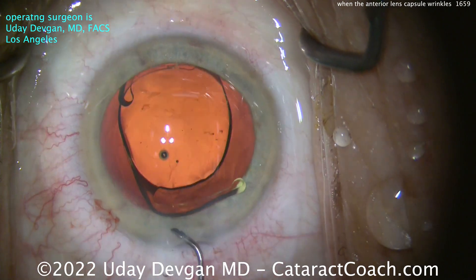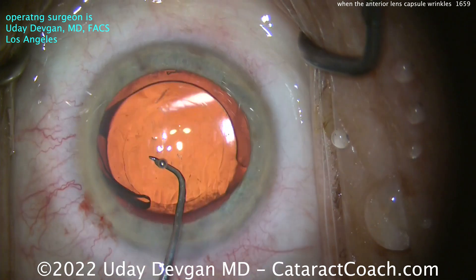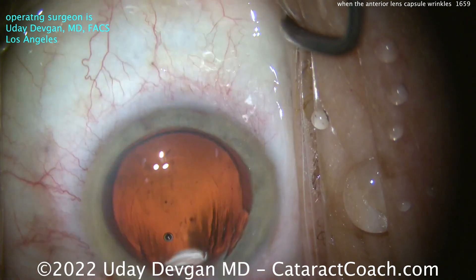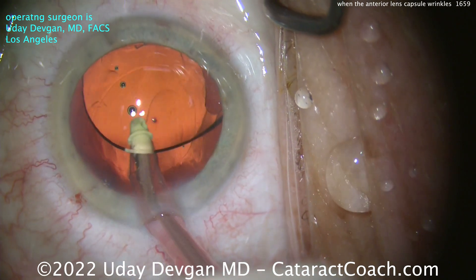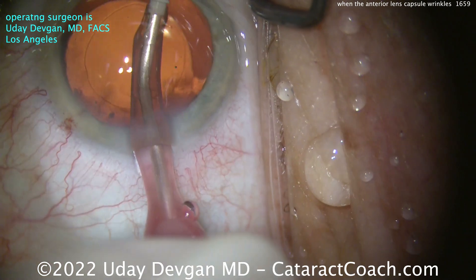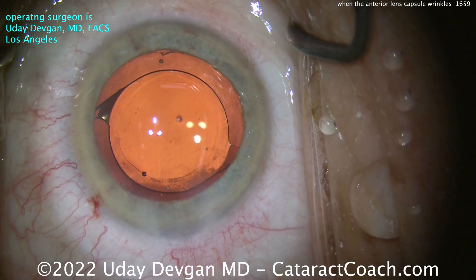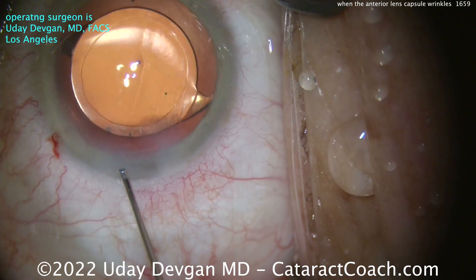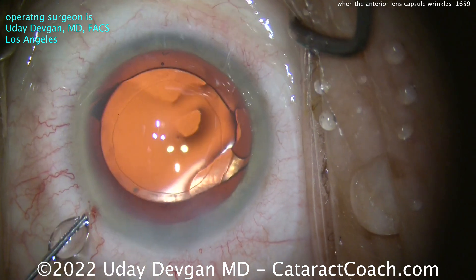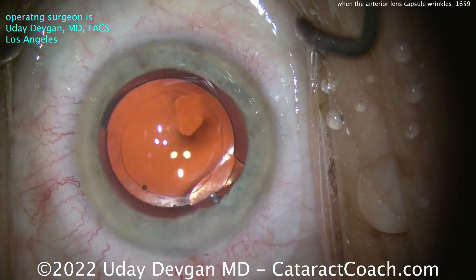Not sure why I had capsule wrinkling at the very beginning. Maybe the forcep tips weren't sharp enough, maybe the patient has a thicker than average anterior lens capsule, or maybe it's just global zonular weakness as you'd expect in someone almost 90 years old. All's well that ends well. All we had to do was use something sharper to poke into the anterior lens capsule — for most surgeons that'd be a cystitome, for me it was just the side port blade. There's that 5mm rhexis overlapping the optic beautifully, stays centered, lens looks great. This patient had a beautiful outcome with no issues, no pseudophacodonesis — the lens is very stable. So when you see capsule wrinkling in the future, be cautious, but sometimes you can just do a normal case.